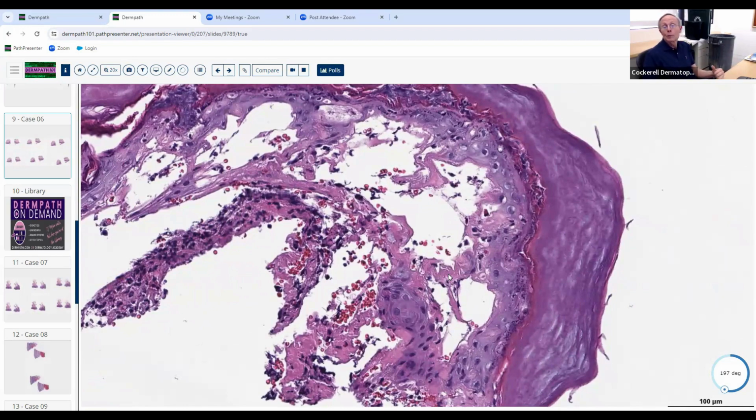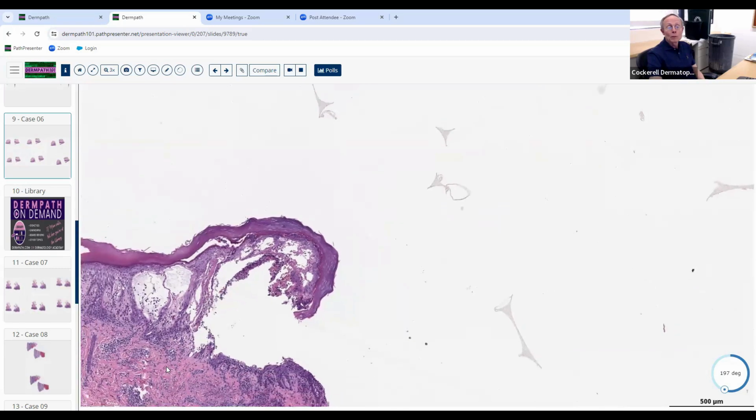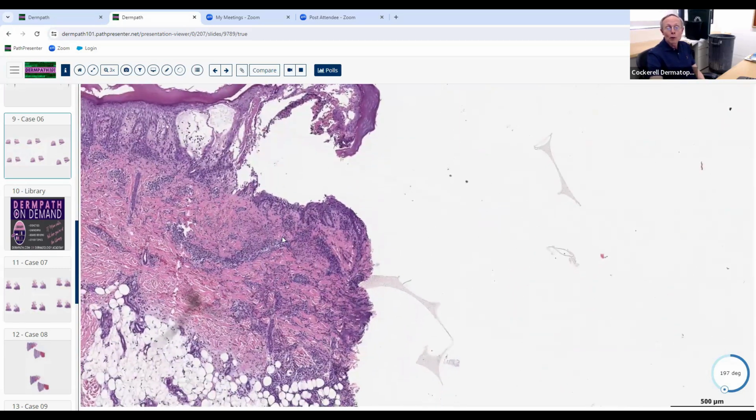I might look at it and come up with a different diagnosis and suggest that, given the fact there's some eosinophils here. I would also probably say, well, could this be some kind of an unusual phototoxic drug eruption? Could it be an unusual bug bite reaction? Because there are EOs. So I wouldn't just get this cold. You'd have to have more information here. So don't expect that, gosh, how would I know this without any information? They're not going to ask you that.